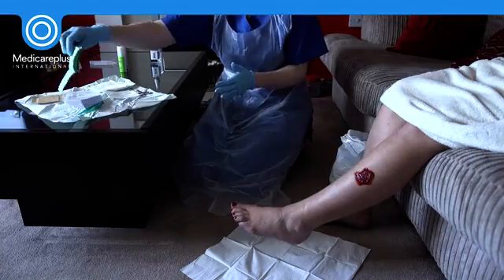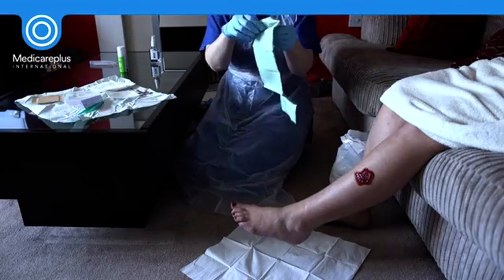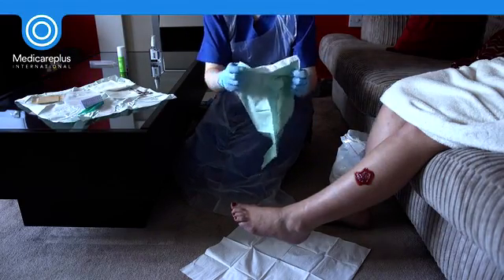The wound can now be redressed using the prepared dressings, avoiding touching key parts on your working field.